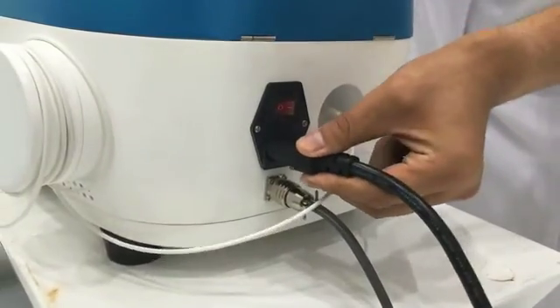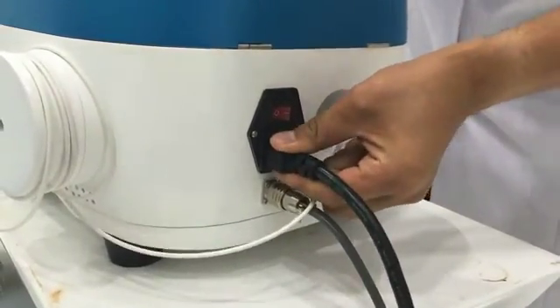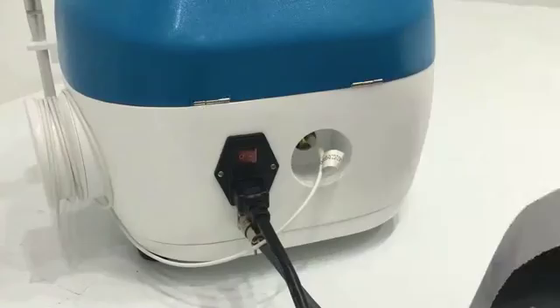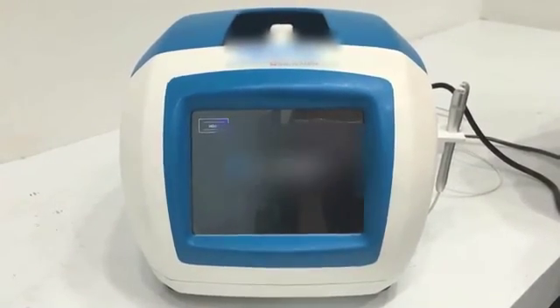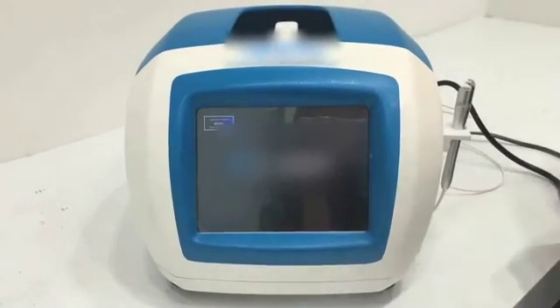Debugging. First, plug in the power line. Press the turn on/off button and the machine will be switched on. Let us start to learn the operation interface.